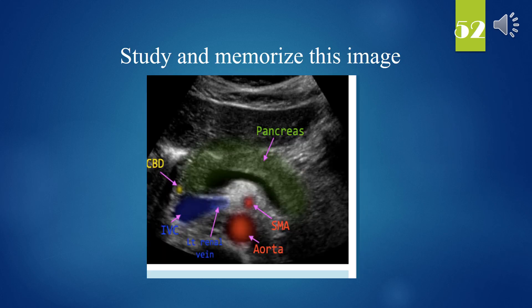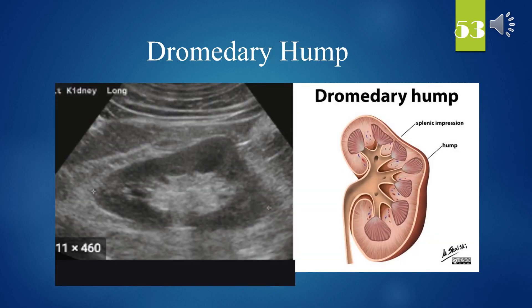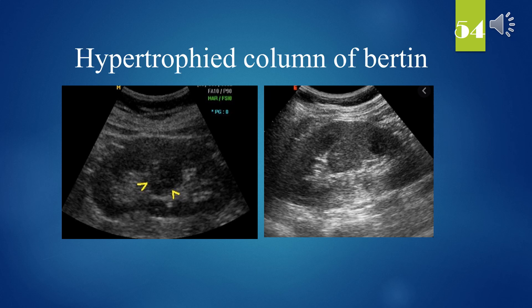Study and memorize this image. What is that? Dromedary hump. The yellow arrow is 0.2. Hypertrophied column of Bertin.